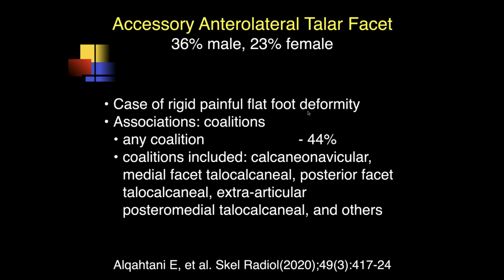And I think now most people, when you get a lot of these degenerative changes, put this more into the category of adult acquired flatfoot deformity. In some papers, people think it's a congenital abnormality of the anterolateral talar facet.